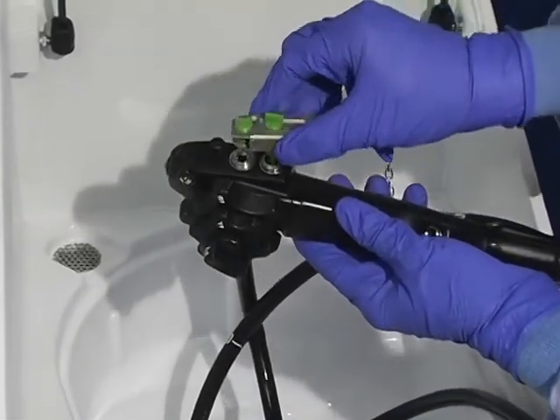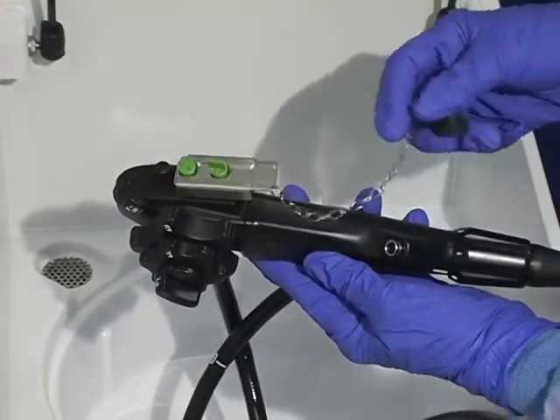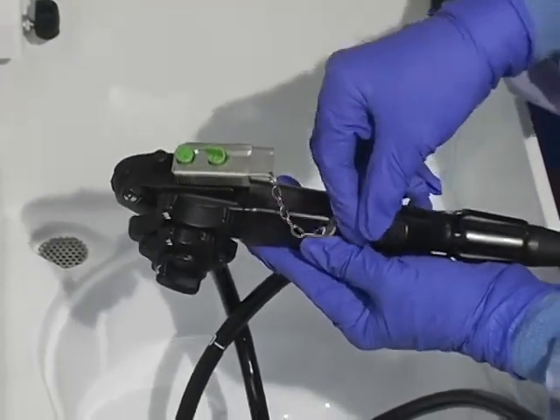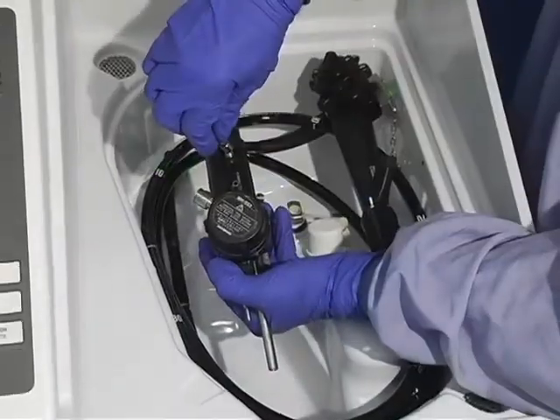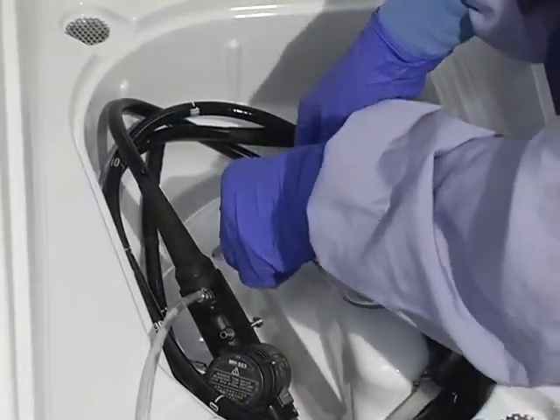Attach the channel plug in the endoscope valve cylinders and attach caps onto the instrument channel port. Attach the forward water jet connector, gas and biopsy caps as needed.